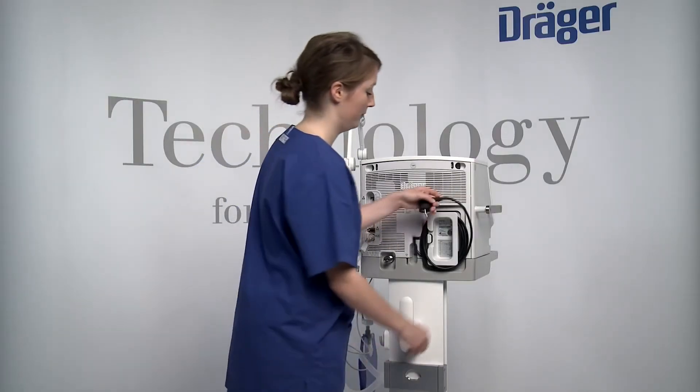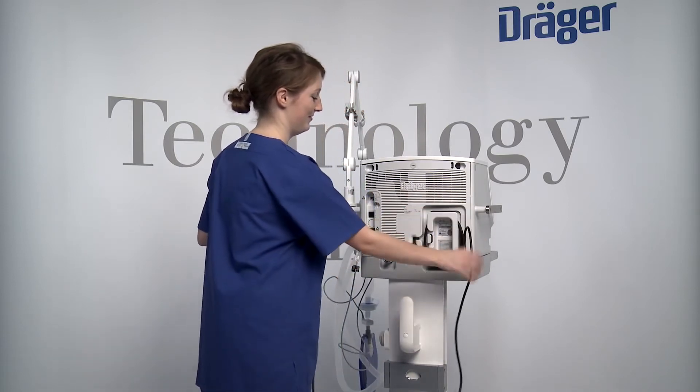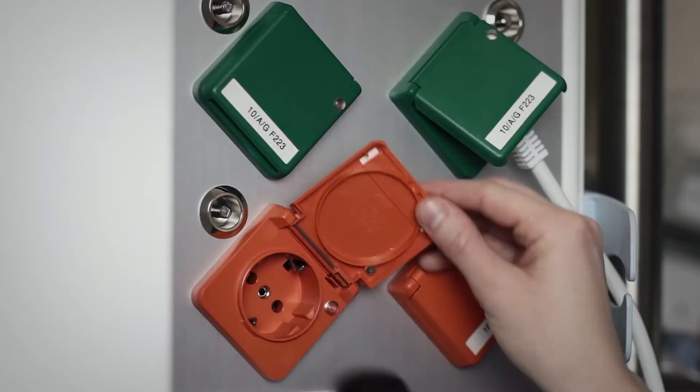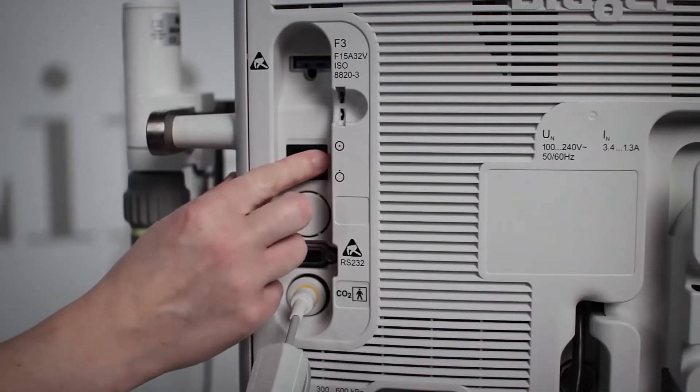Insert the connector of the CO2 sensor into the socket on the rear of Savina 300. Savina 300 is supplied with mains power or with power from the internal or external battery. The external battery also serves as the power supply during patient transport. Insert the mains plug into the mains power socket. The LED lights up green.